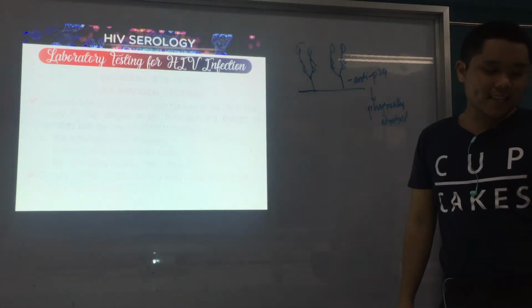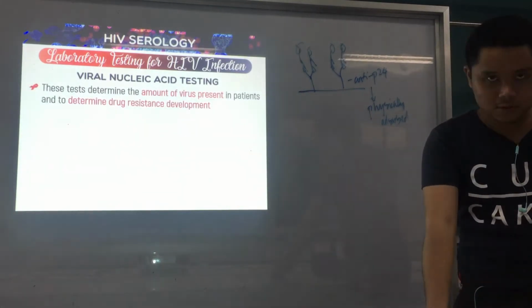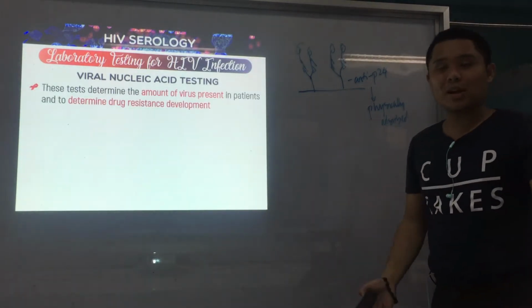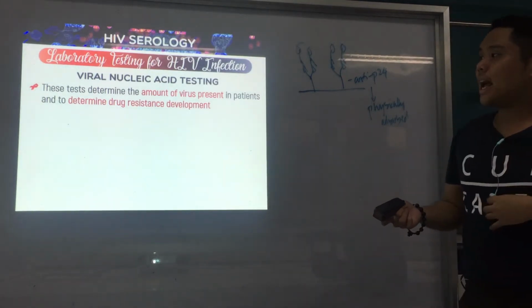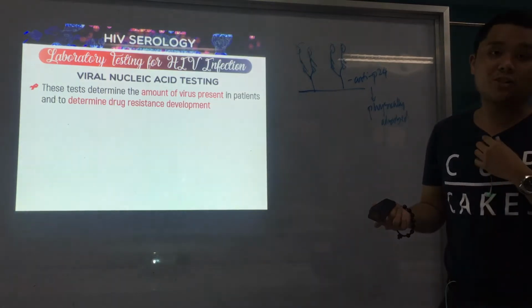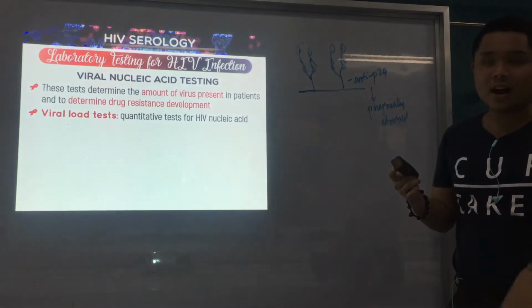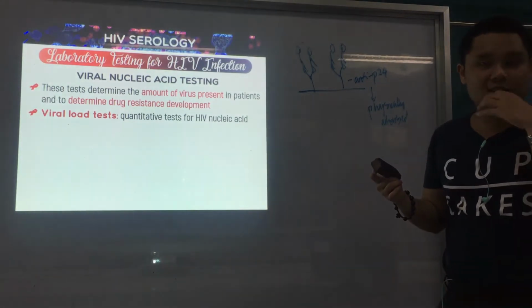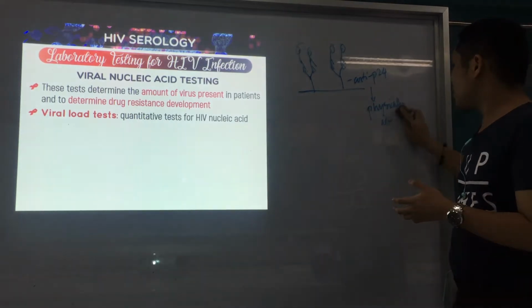Okay. Next is viral nucleic acid testing, the last type. By the name itself, it's a quantitative measurement. So we want to determine the amount of virus present and also determine drug resistance patterns in patients. Again, it's also known as your viral load tests. I think you're familiar with that. You've heard about that, right? Viral load tests, quantitative tests for HIV nucleic acid.